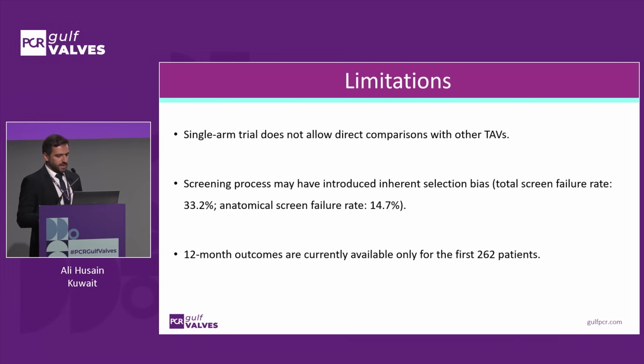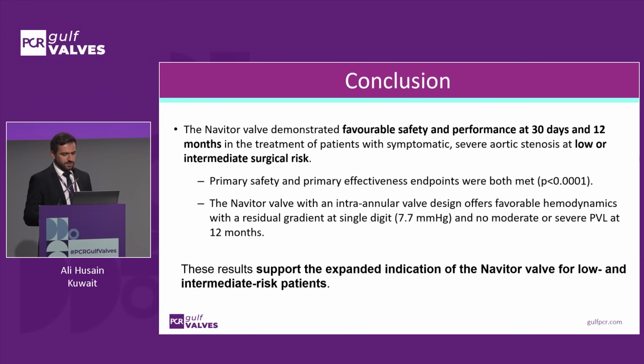So as with any other trials, there are always limitations to any study, and this is a single-arm trial that really doesn't allow comparison with other platforms. There is a 30% screen fail, so that may have introduced some selection bias, and the 12-month outcomes I just presented were only available for the first 262 patients.